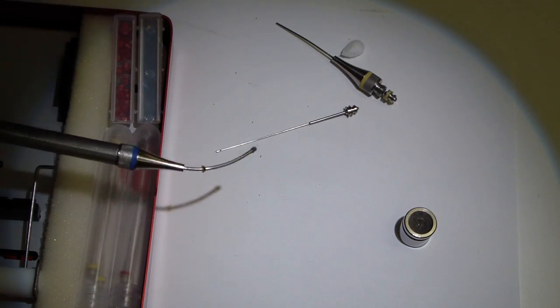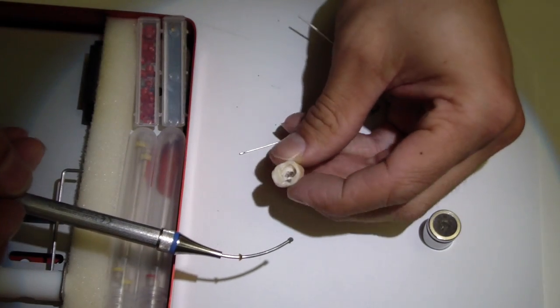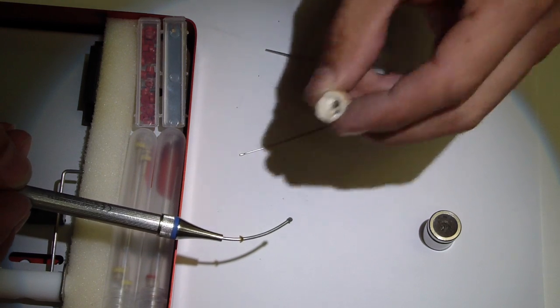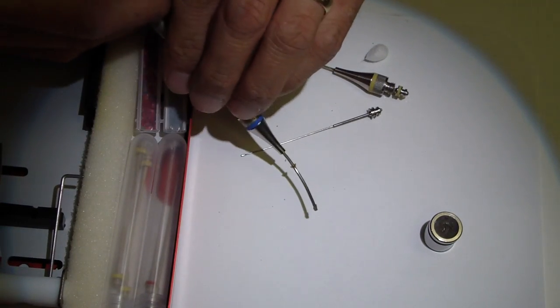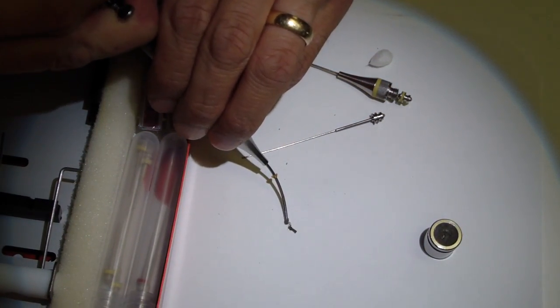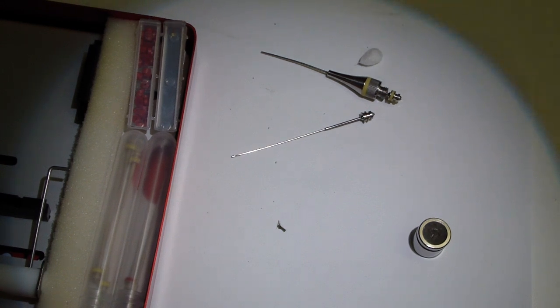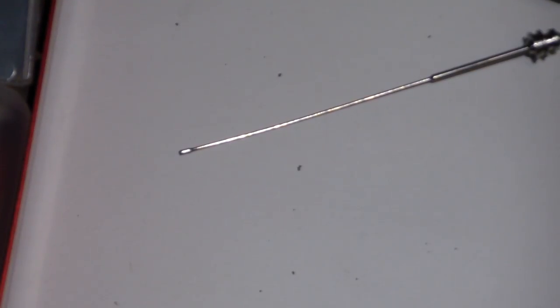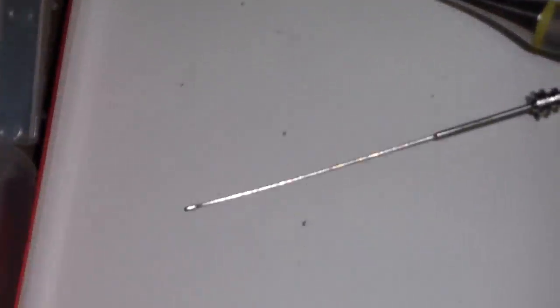Now we would take this into, say, our furcal perforation on this tooth and place it. But before we do that, let's extrude some of this onto the paper so you get an idea. You can see that is what would be delivered. Let's see if I can zoom in on that. And they say dentistry's not exciting. That's the amount that would be extruded, and then you use your condenser, ultrasonics, etc., to pack it into the location that you need.